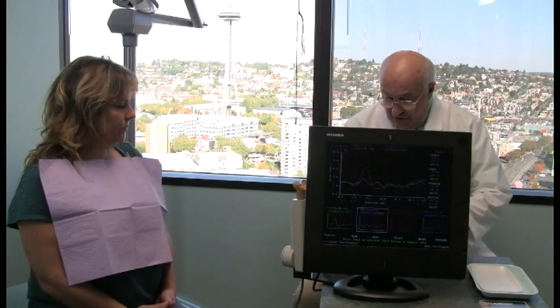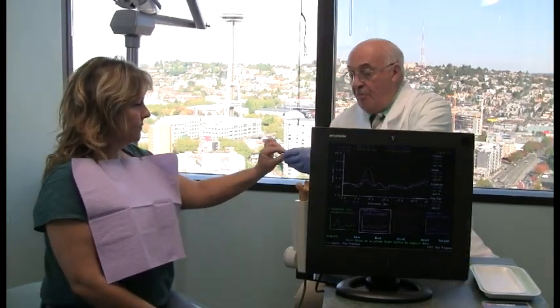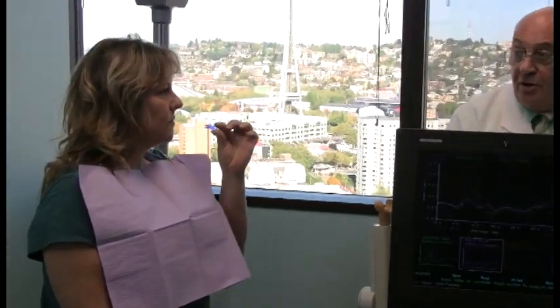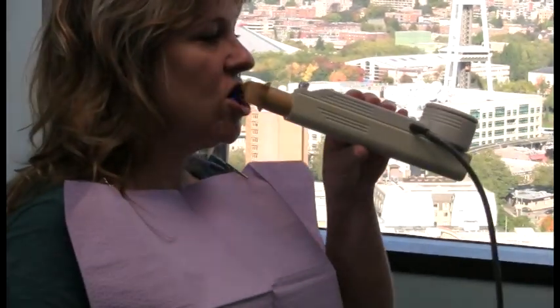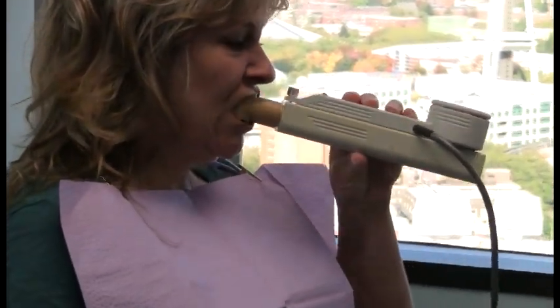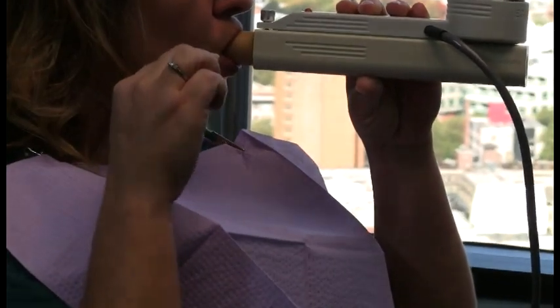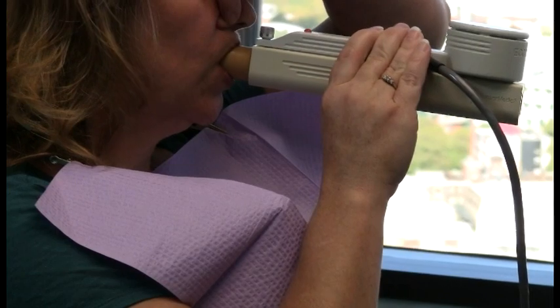And so, Teresa, as you recall, when I hand you this, the number that is going to position your jaw, which happens to be a 2, is facing toward you. So when you're in the upper first notch, you're 2 millimeters forward. And go ahead and just position that. Okay, and would you just pinch your nose, please? And here we go.